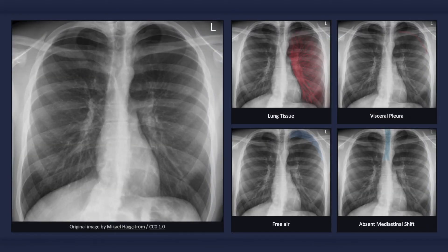To quickly recap, with a pneumothorax, a thin sharp white line — the visceral pleura — separates the lung and the free air, which is void of bronchovesicular markings. As well, in the case of a simple pneumothorax, there will not be any signs of mediastinal shift.